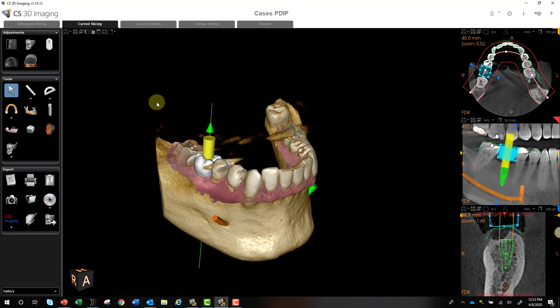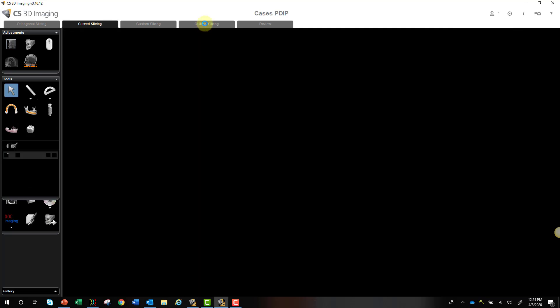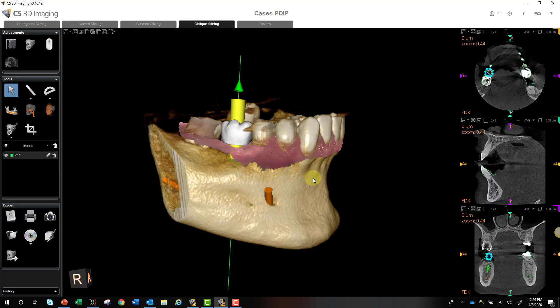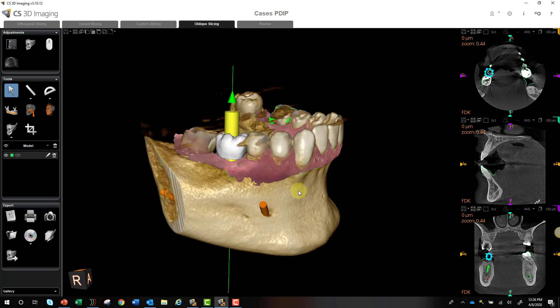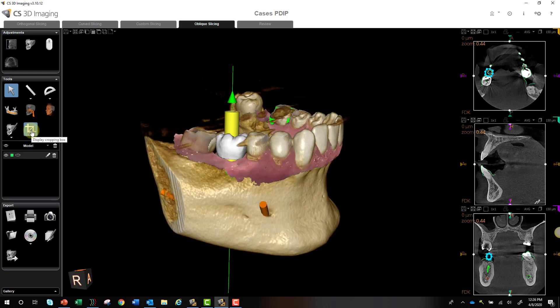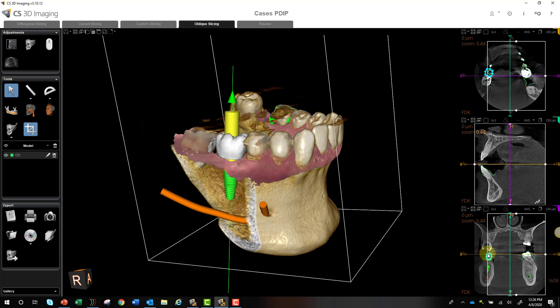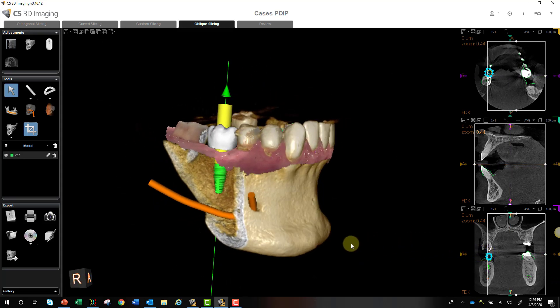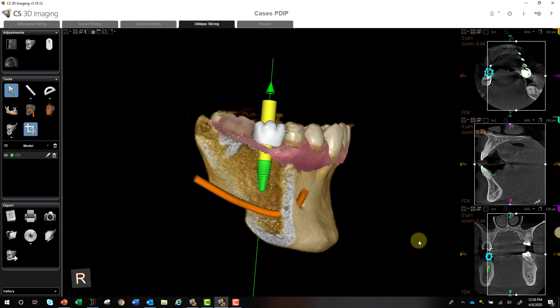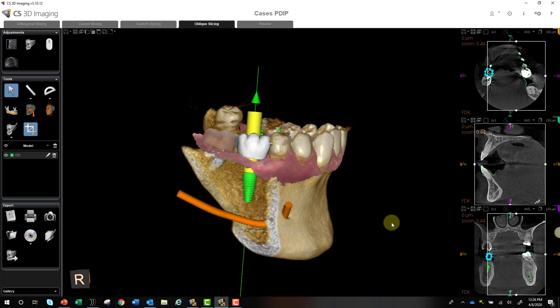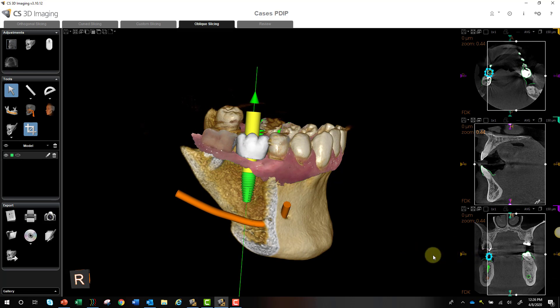One last trick: if you go into Oblique Slicing, there's a cropping tool. You can move the nodes to crop out your plan, which is great for a show-and-tell with patients — showing them what's happening on the inside. It's not strictly necessary, but from a wow-factor perspective it is pretty nice. Hope this all helps. Feel free to reach out with questions. Thanks.